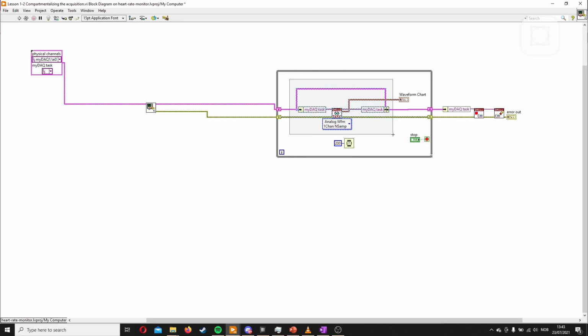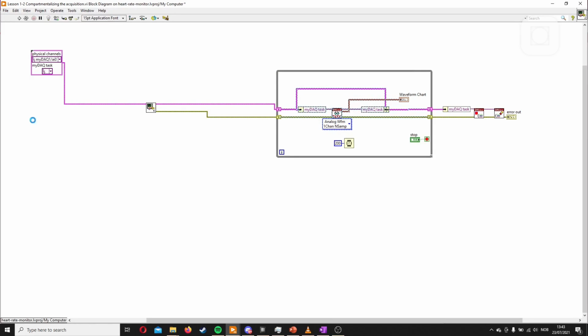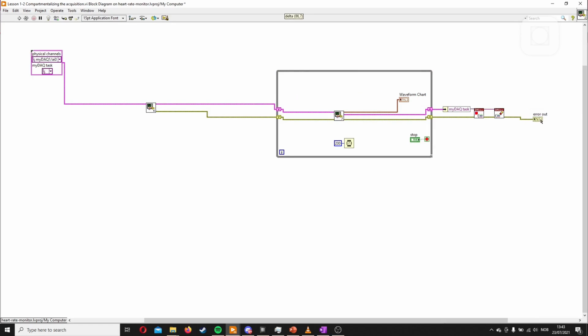So we'll mark everything here and edit and create sub-VI. So that's our read sub-VI. And lastly, we want our close sub-VI. So just mark this one too, edit, create sub-VI, and there you go. Now we have all our sub-VIs.